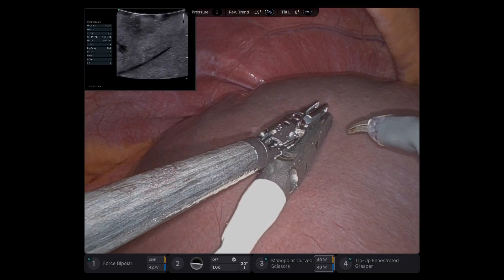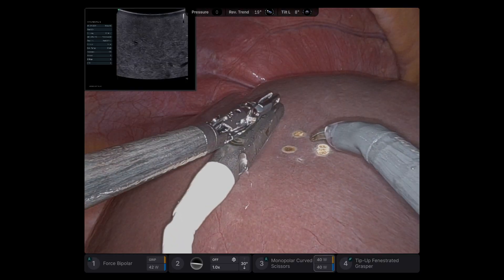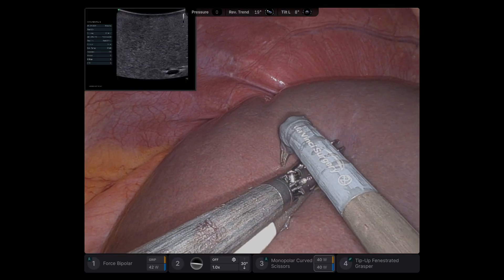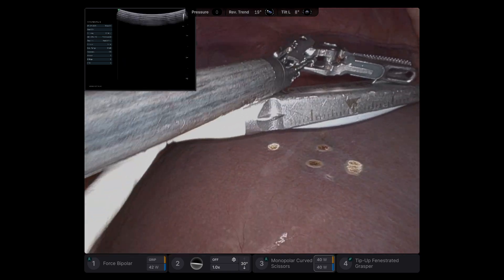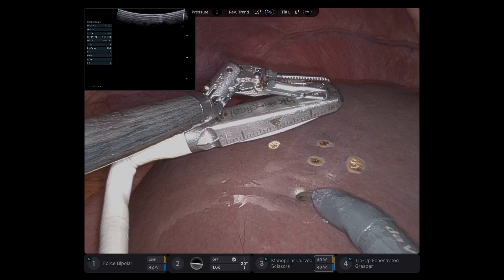I usually mark where the tumor is, and when it disappears with the ultrasound, I mark on the other end of the probe — that gives me roughly a 1 cm margin. I move the ultrasound probe until the tumor disappears, then mark on the other side of the probe.